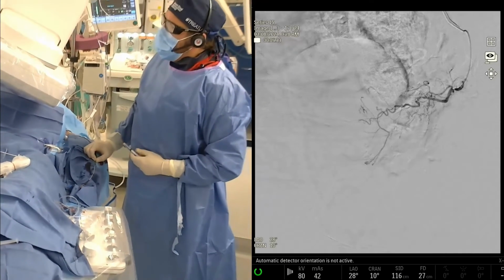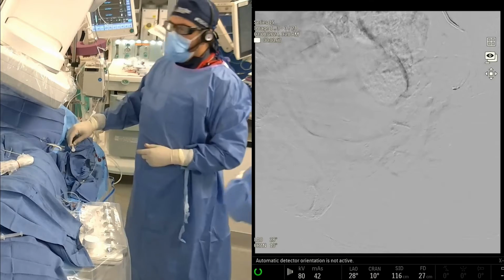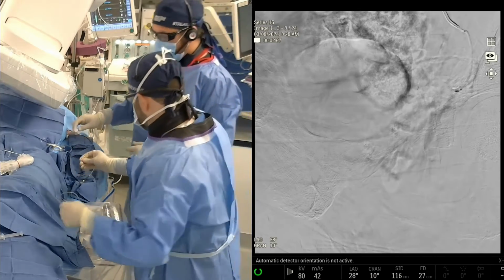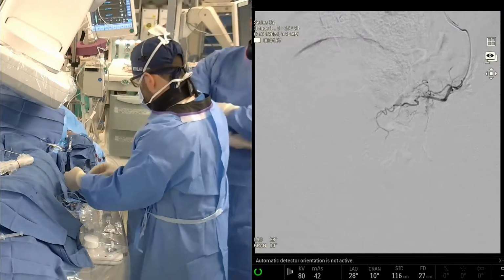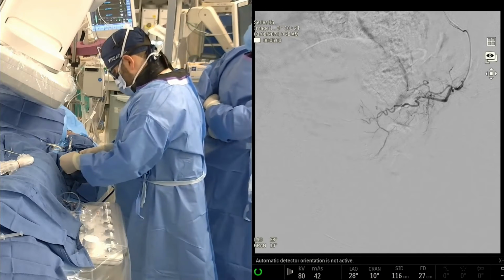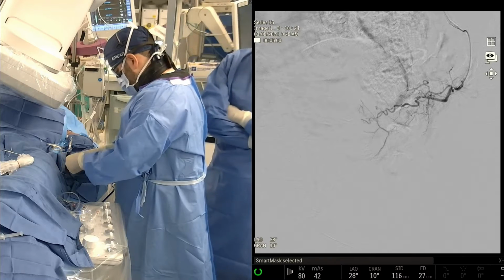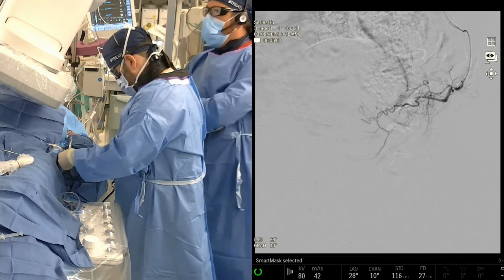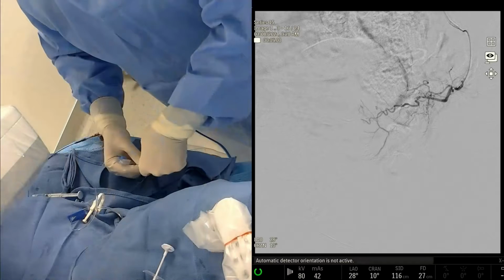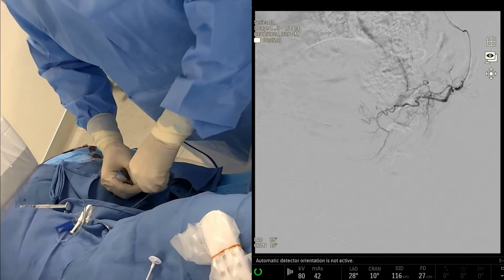Were you originally using cone beam CT in these scenarios and you come away from it? Well, cone beam CT is really used, I think, for three scenarios. You could put that up, Debbie, as a roadmap. Number one, looking for the prostate artery using embolization guidance or something along those lines. So that's one. The second reason is potentially to look for collaterals and other feeders.